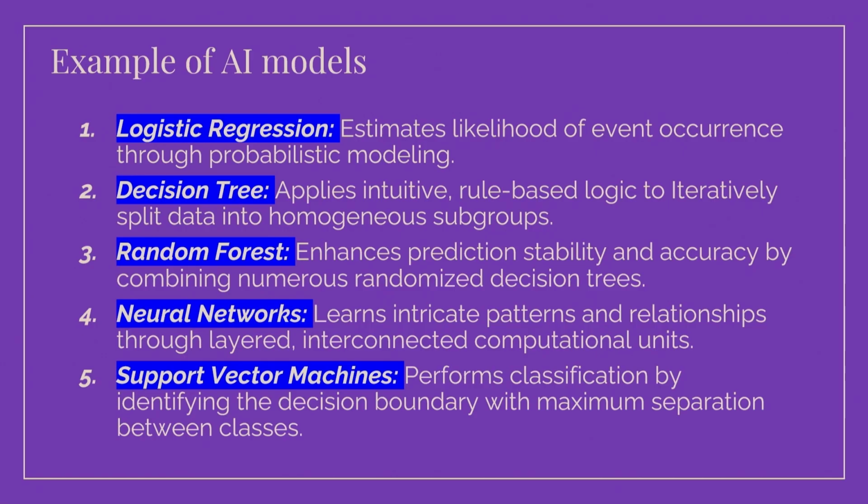And then later in the second layer, if I confirm I will go for breakfast, the next question will be which restaurant I will go to. For example, I will go to Cha Chan Tang or to have dim sum. And then there's a decision tree from the very first layer to the end of the layer, which is your question, for example in this case, whether the patient has cancer or not. So different AI models can be employed because they use a very similar gist as human thinking.